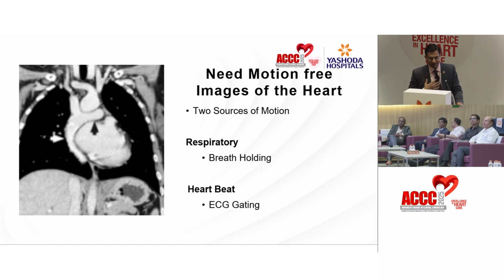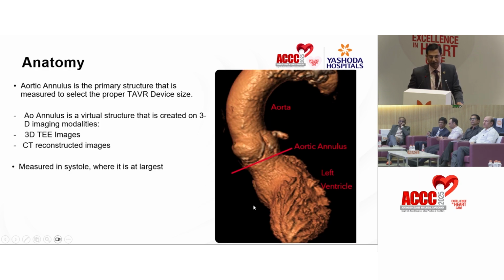My belief is that if you prepare a patient properly, you can use a recommended dose of contrast in most of the patients. It's important that breath holding should be there. It should be ECG-gated, and the reason is that you need to determine the dimensions in systole. And if by any chance we are not able to do a CT angiography in such patients, you can alternatively rely on a 3D transesophageal echo. But yes, there are chances that you can underestimate the dimensions, and you have to factor that in when you are deciding the valve size.